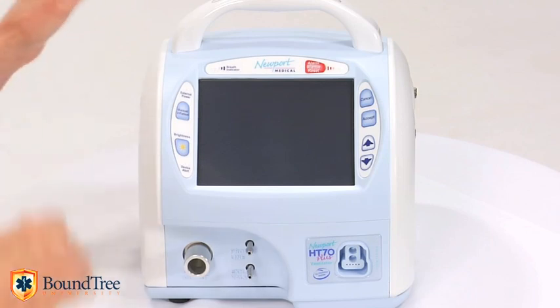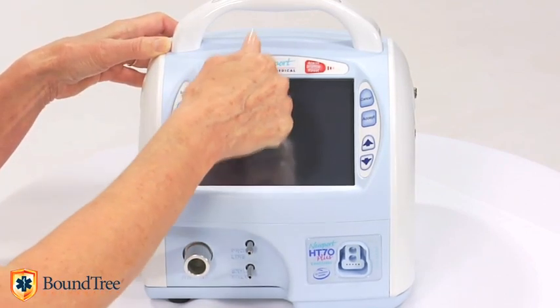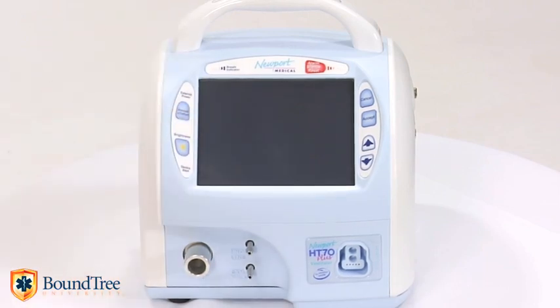The HT70 is made of high-impact plastic, and the touch screen is covered by a thick acrylic shield so it can withstand rough treatment. It is tough on the outside and friendly on the inside.